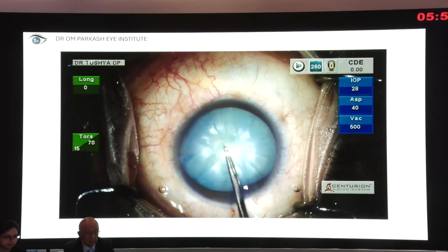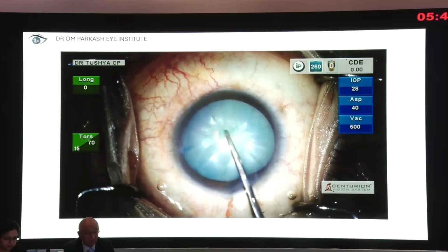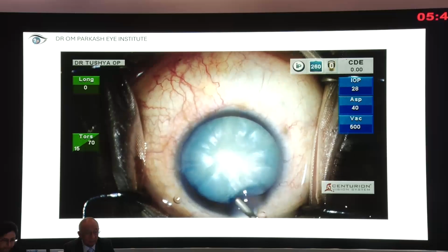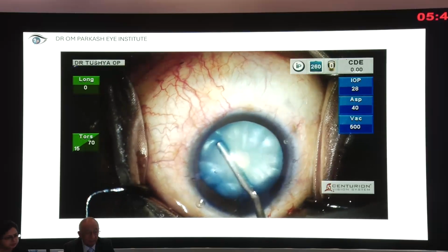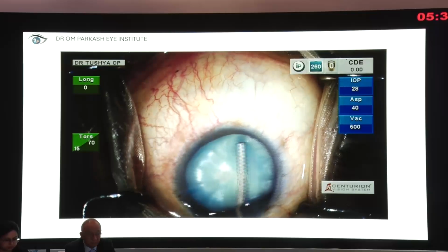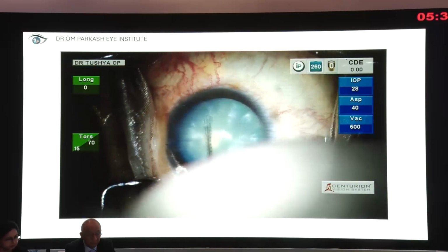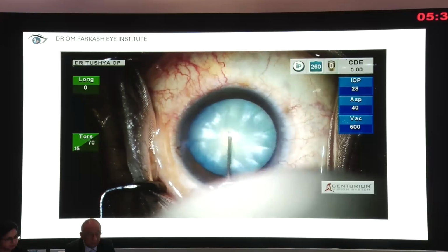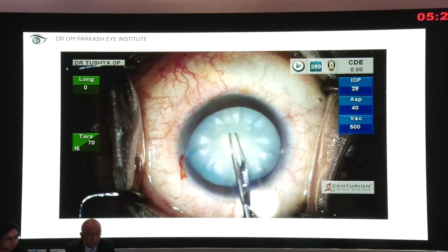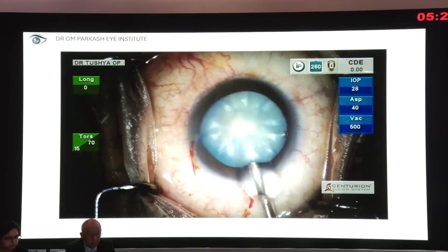And then you make a small baby rhexis, and once you make that rhexis in the decompressed part, you do, as described by Professor Chi, capsule milking, where the lenticular fluid from the mid-periphery and the peripheral region is brought out in the center and being aspirated. And with the 25 needle, I go in, take out the remaining fluid, aspirate it, and then followed by a nick. And then you can see that the area is decompressed in the mid-periphery and the peripheral part.